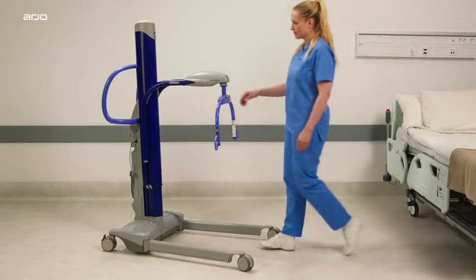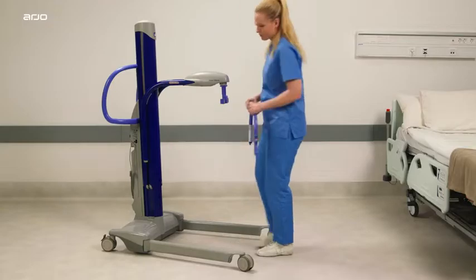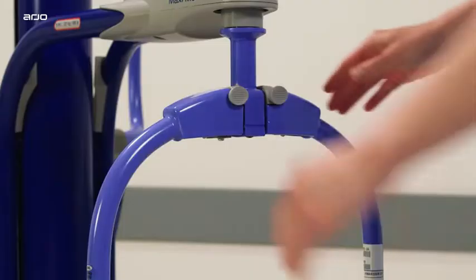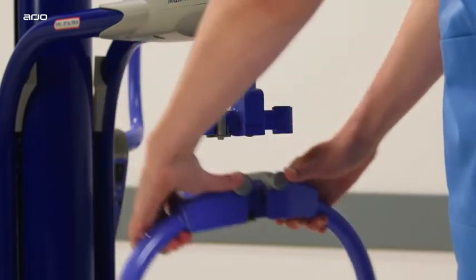To remove a spreader bar or stretcher frame, hold carefully and depress the locking clip thumb pads to release it from the T-bar. Then, still pressing on the locking clip, lift the attachment upwards and away from the T-bar.